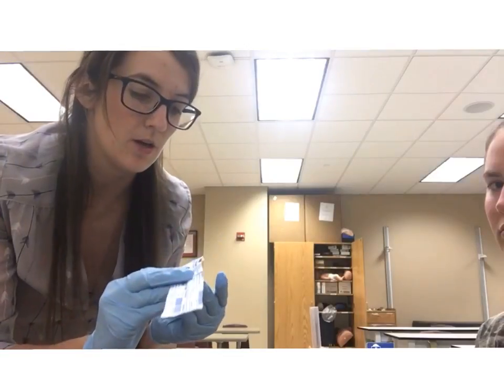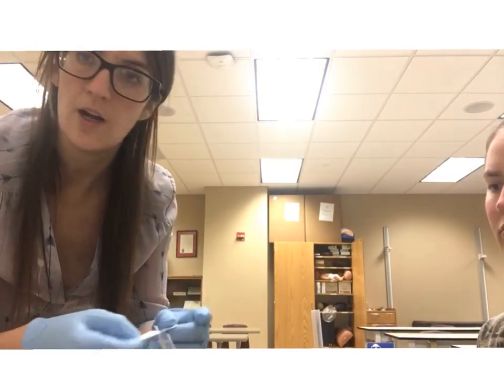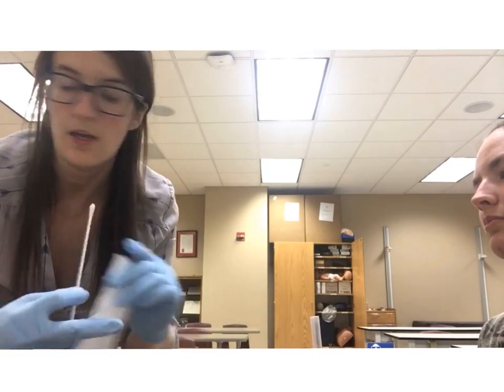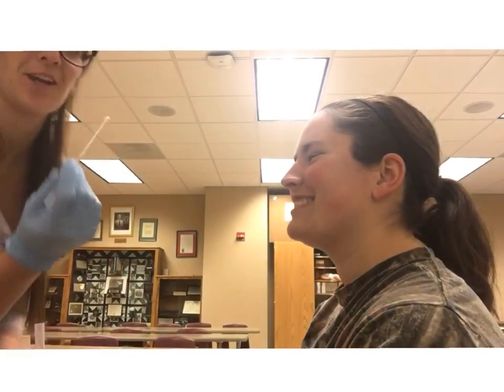Next we're going to open our swab, making sure that you do not contact the cotton end. We want to make sure that it stays sanitary, so we open it carefully.